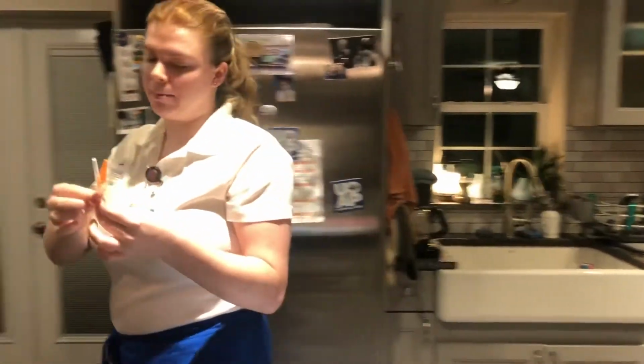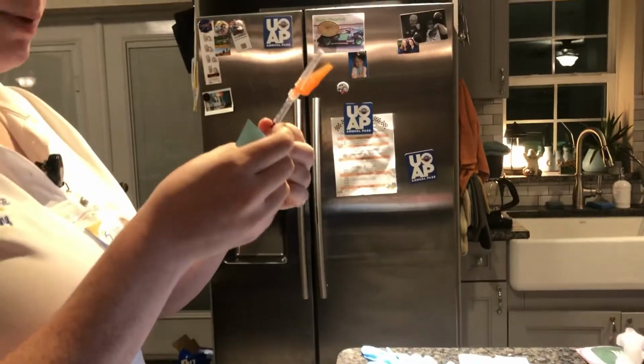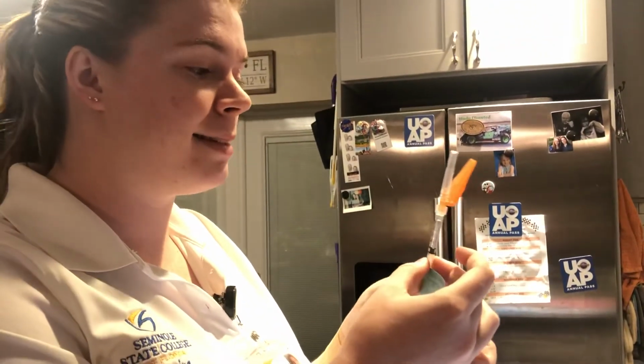And then I'm going to be labeling my needle with the name of the patient, which is Oscar Simpson. The medicine is epinephrine. The amount is 0.5 milligrams. My initials, the date, which is 11/11/2020, and the time is now.